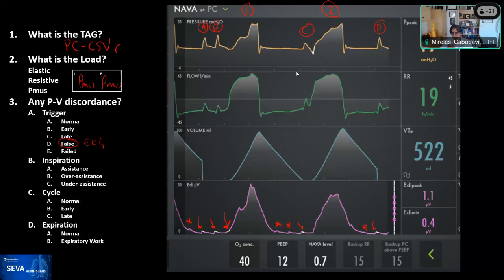What I do recall about this patient and the reason why the patient ended up in NAVA is that we were doing diaphragm protective ventilation because the patient was going for a transplant, and we were trying to support the effort as much as we could because the lungs were extremely injured. That's correct, Karsten. The range usually they try to put it at 15.